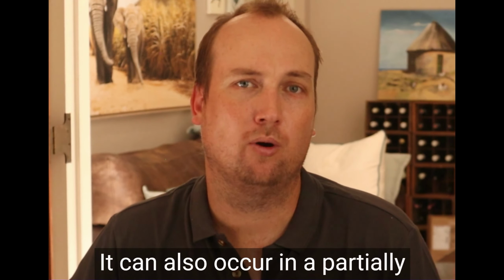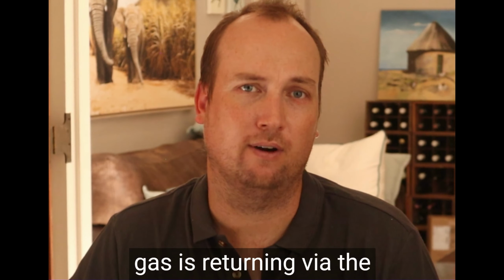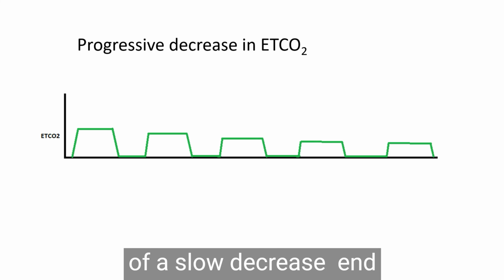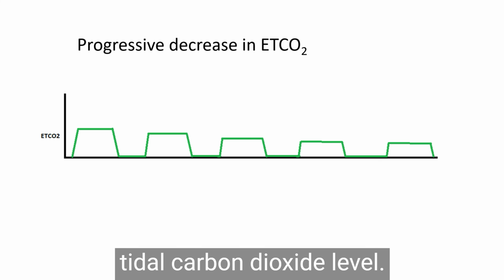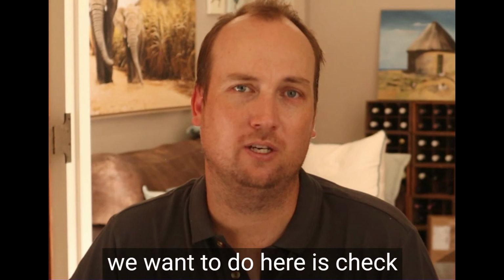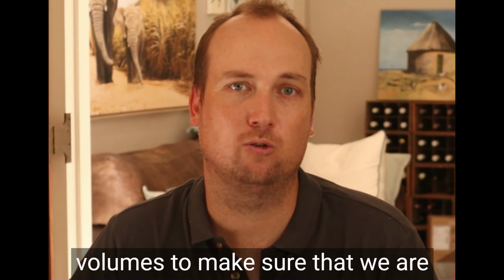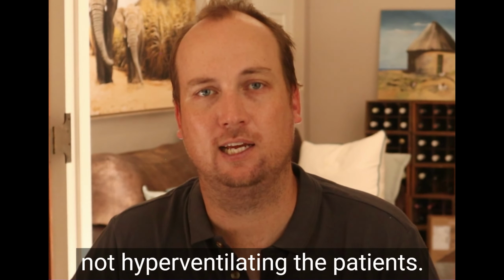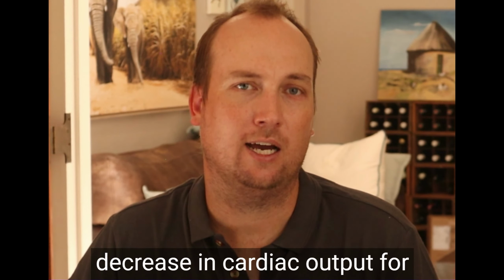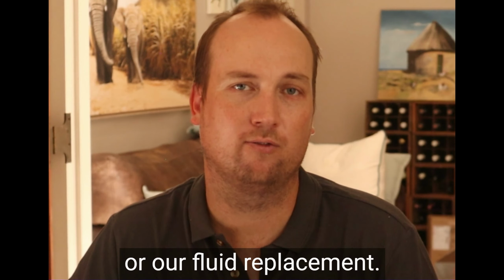It can also occur in a partially dislodged airway, where only some of the expiratory gas is returning via the airway to the sampling line. The next pattern is that of a slow decrease in end-tidal carbon dioxide level. And we can see this in states of hyperventilation. And what we want to do here is check our ventilatory parameters, our respiratory rate, and our tidal volumes to make sure that we are not hyperventilating the patient. It can also represent a slow decrease in cardiac output. For example, slowly falling behind on our fluid resuscitation or our fluid replacement.